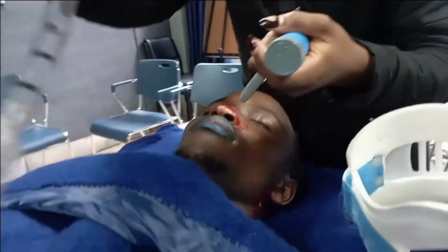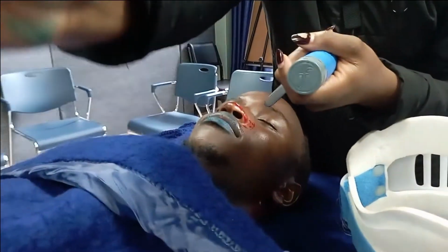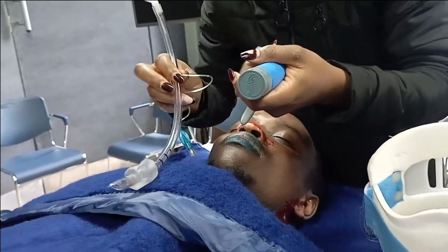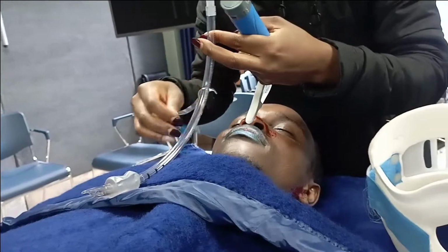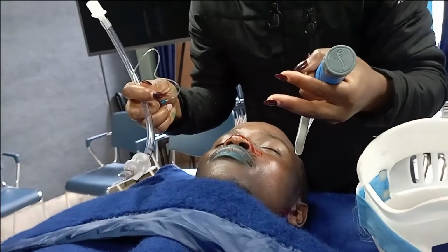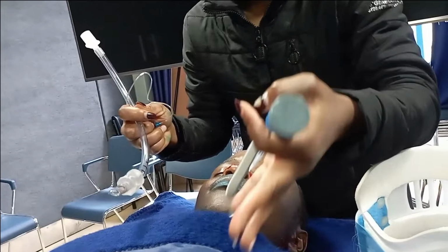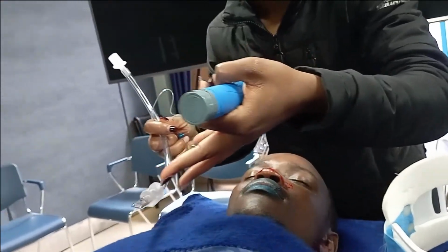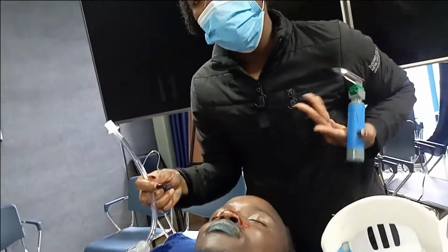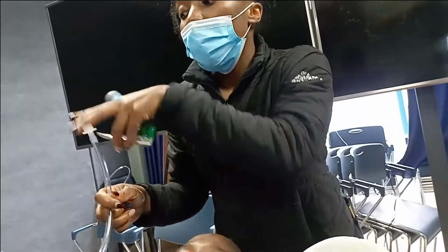My assistant hands over the ET tube in the correct position. ET tube given to you in the correct position. We insert it through the vocal cords. And once it's inside, we cuff, we put air into the cuff. Inflate it. And then after that, we check for position. So we look at the lungs and the chest for a chest rise. We also auscultate the epigastrium to see if there's any air going into the stomach. Meanwhile we connect oxygen.